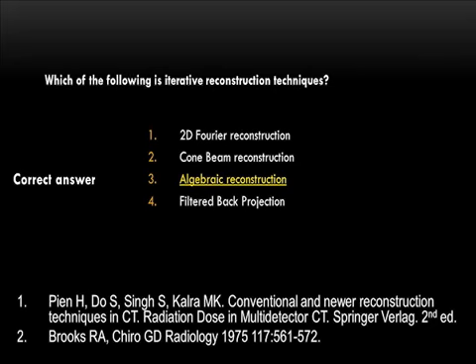It's the algebraic reconstruction technique, which is classified as an IR algorithm.